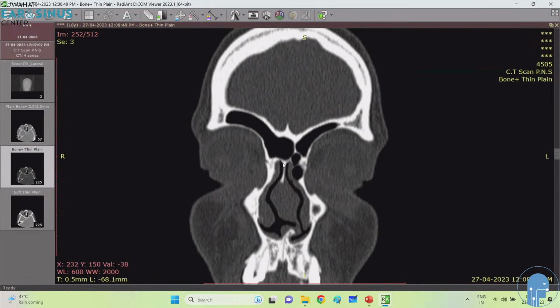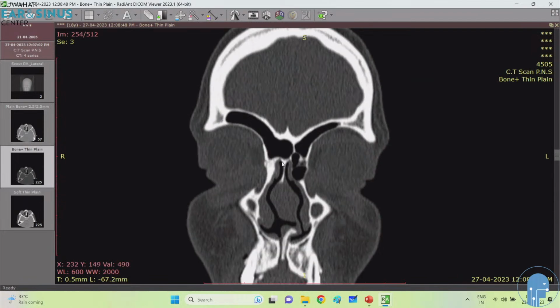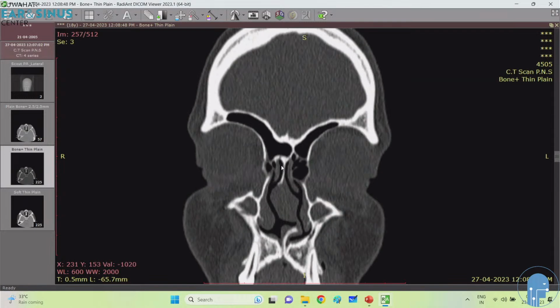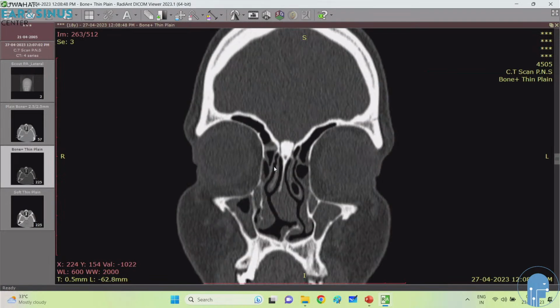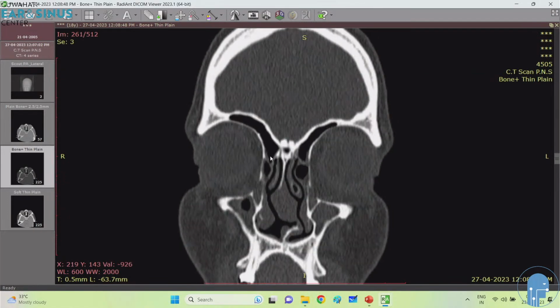This is the nasal process of the frontal bone, and from that area you can now see the appearance of the middle turbinate. As Rohan has said, this is the appearance of the agger nasi cell and middle turbinate, and you can appreciate the frontal drainage pathway is lateral to the middle turbinate here. And he has already mentioned all the new classification and how we can appreciate it.